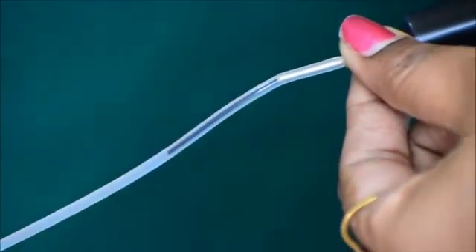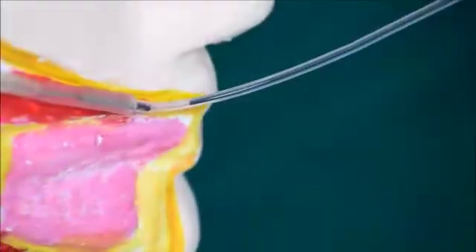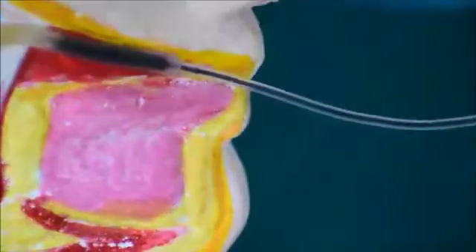The contrast media suitable for sialography is iodine-based. They are available as water-soluble media or fat-soluble media. The cardinal rule is that the injection should be stopped when the gland is full or when the patient experiences mild discomfort.